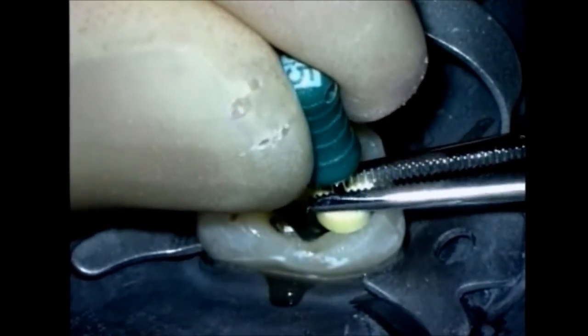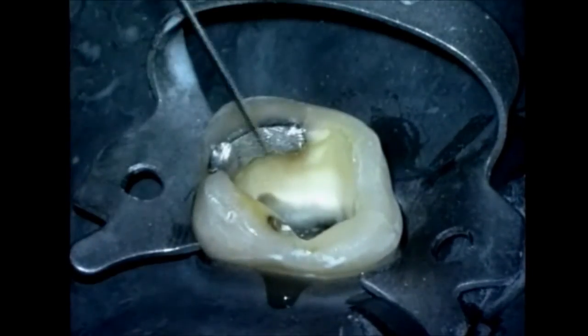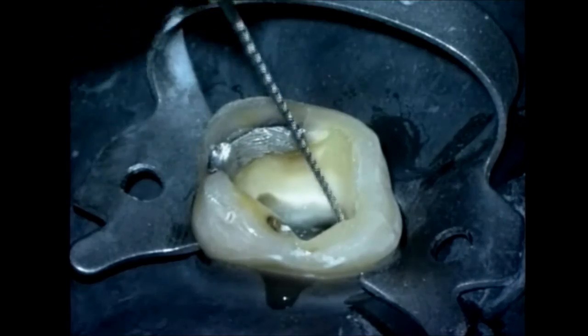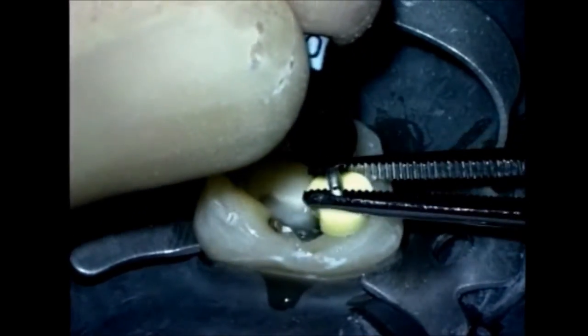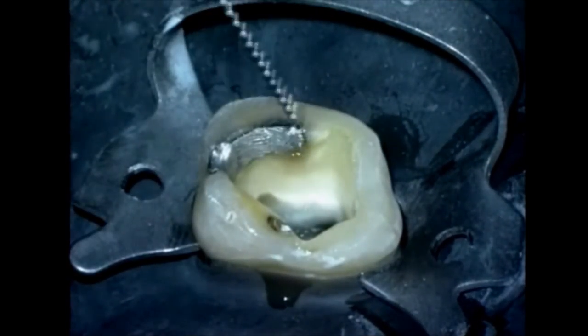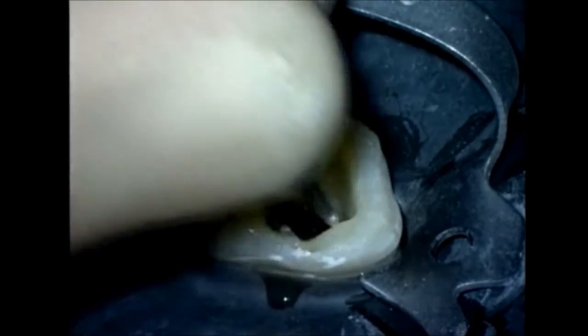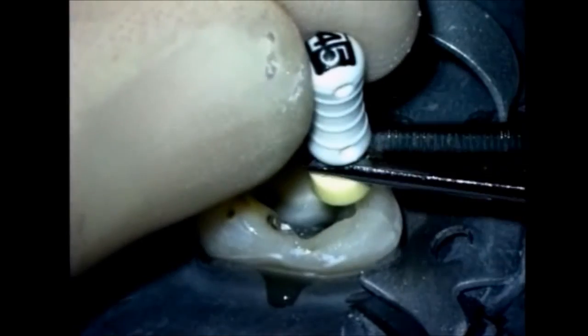Recall the 35 through 60 hand files are nickel titanium. These highly flexible instruments will be easily inserted into the canal. When the handle is just snug, the assistant pushes down the rubber stop, and we can begin to see more gap between the top of the stop and the plastic handle. This again reassures us that each larger instrument is moving further and further away from the terminus.